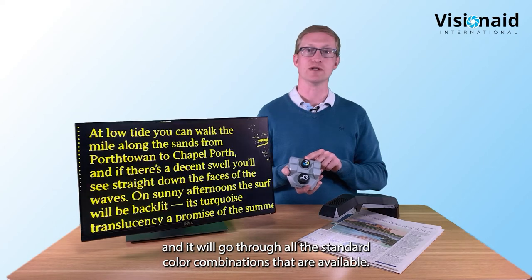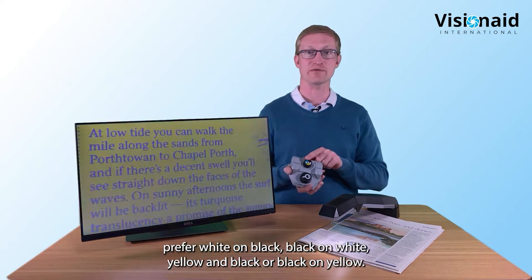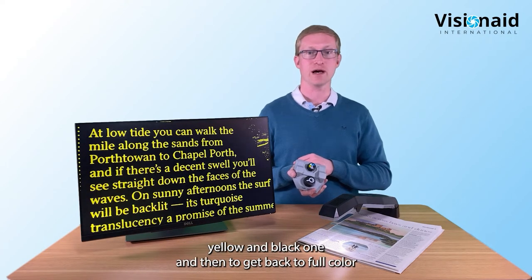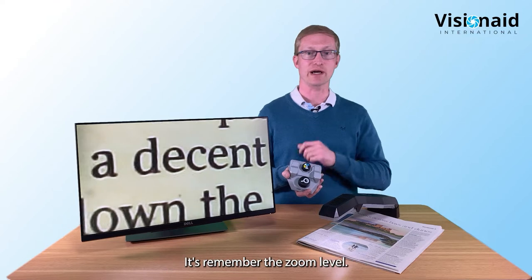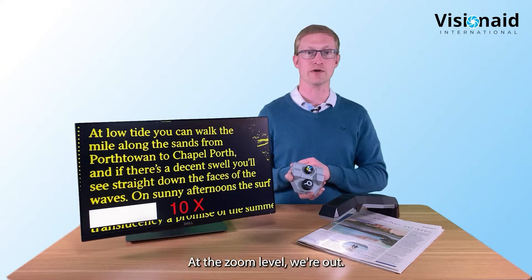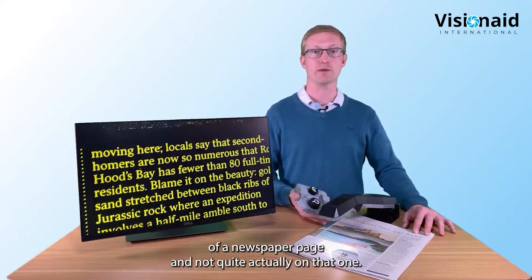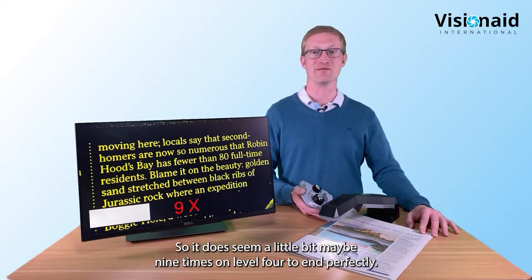While in two-color mode you can rotate through all the standard color combinations. 99.9% of people tend to prefer white on black, black on white, yellow on black, or black on yellow. To get back to full color, you just click the dial and it remembers the zoom level you were at. At nine times on a 24-inch screen, you can fit the full column of a newspaper page without having to slide left and right.